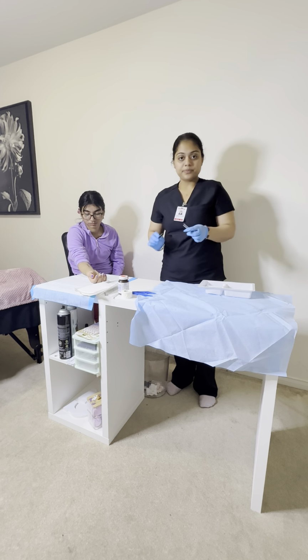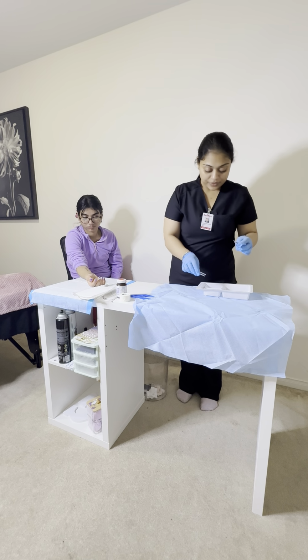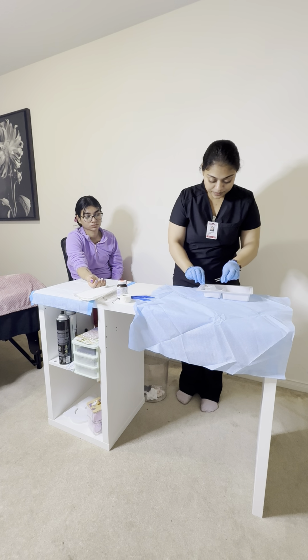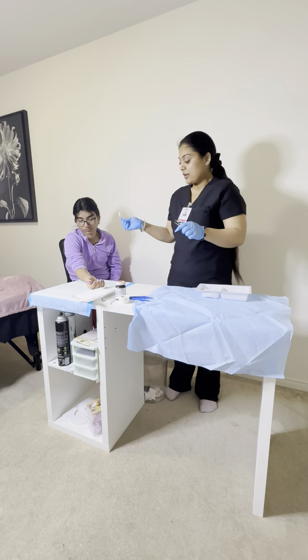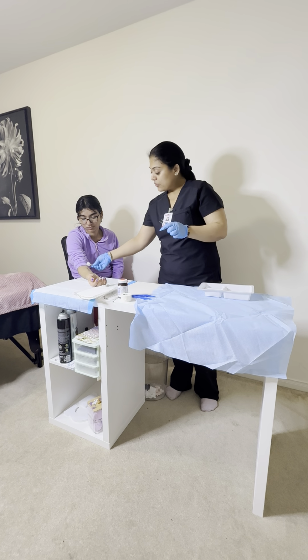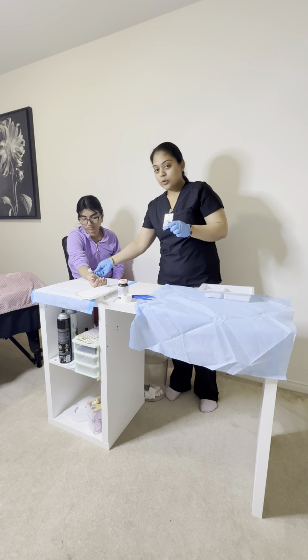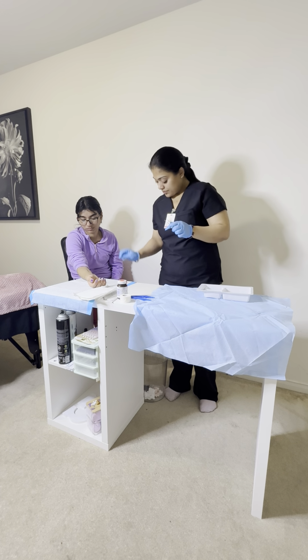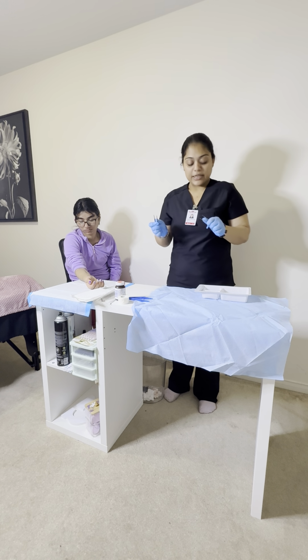Putting it in the dustbin. Now I am going to pat dry the wound with the gauze piece. I am doing it again in the same technique. Going to pat dry from the center, from top to bottom, using one stroke, one swab technique.